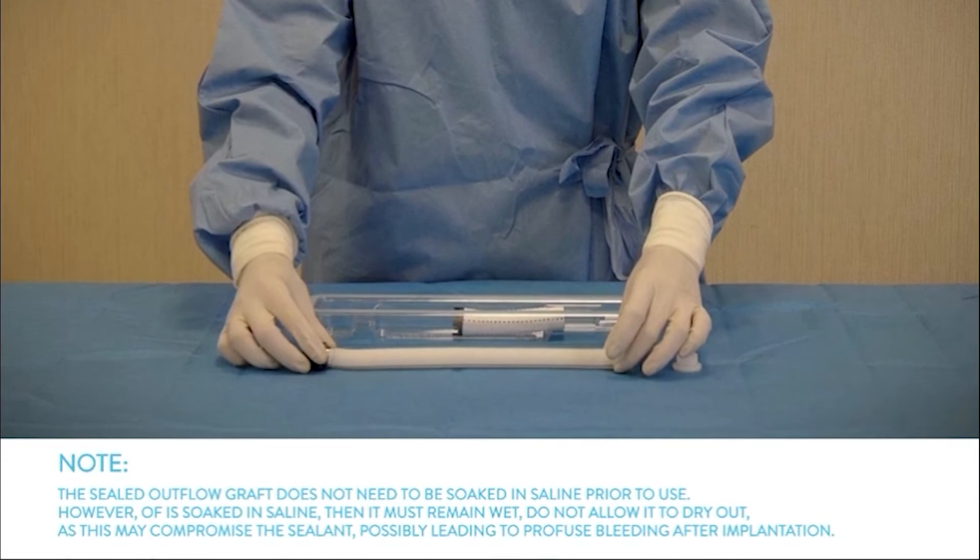Please note that the sealed outflow graft does not need to be soaked in saline prior to use. However, if it is soaked in saline, then it must remain wet. Do not allow it to dry out, as this may compromise the sealant, possibly leading to profuse bleeding after implantation.